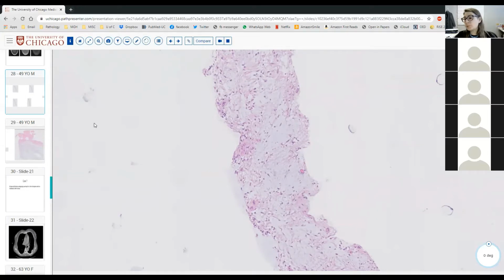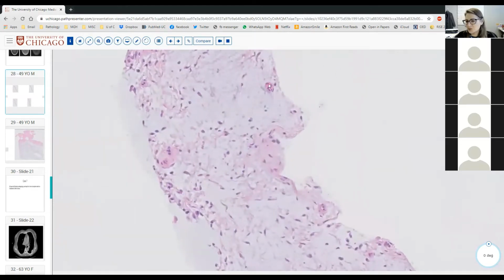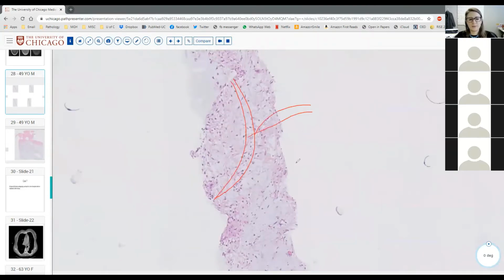Mm-hmm. Most tumors need vessels just to survive, right? So you are generally going to see some vessels in all tumors. In this case, they're more small capillary-like vessels. I agree that you don't really see the very characteristic curvilinear, chicken-wire type vessels of a richly vascular neoplasm. But what's the other difference in this case? Where do you expect to see angiomyxomas?